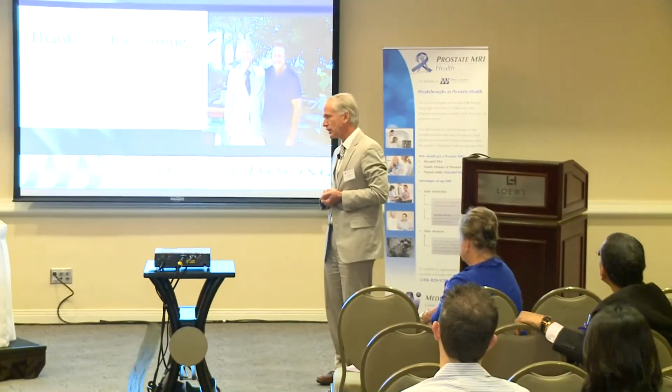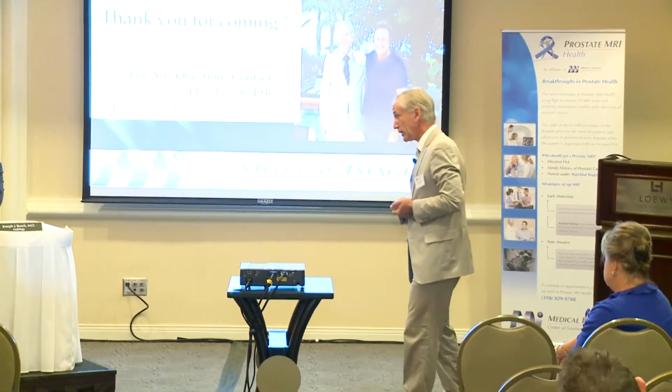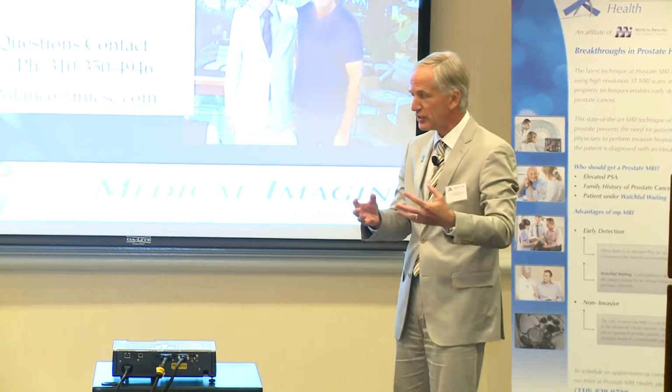Is there a good correlation with color Doppler ultrasonography with contrast and elastography? Very good question. Recently, we revised the guidelines in my country, and we had to give an advice on power Doppler ultrasound, contrast analysis, ultrasound elastography, and histoscanning. And at this moment there's not enough evidence that these techniques are as good as MRI. Yet there's no proof. With power Doppler and with enhanced Doppler, so with contrast agents, you see vascularity. And vascularity with MR, the DCE, is the least important technique to grade and detect aggressive tumors.